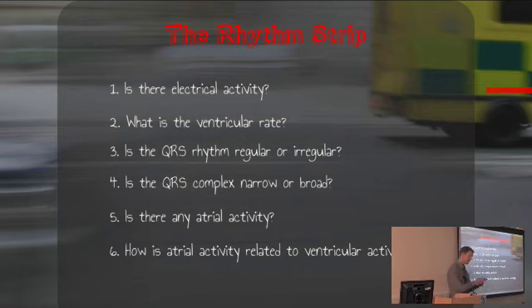Yeah, so you're going to struggle for a 6 centimeter strip. Yeah, like a block. So that's one way of doing it, isn't it? Everyone will look at different things, but you might look at 1 second worth of ECG complexes, count how many there are, and times it by 60. You might look at 6 seconds worth, and then times it by 10. That's probably quite an easy way. Those are the sorts of ways, aren't they? Has anyone used that one? Work out 6 seconds worth of ECG strip, count the complexes, times it by 10, and put your rate.